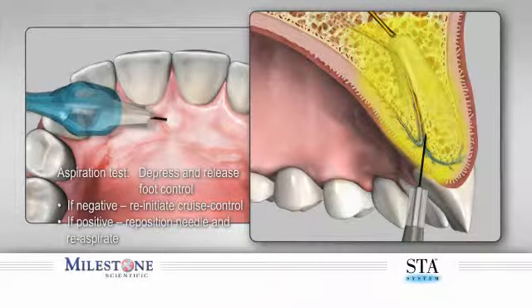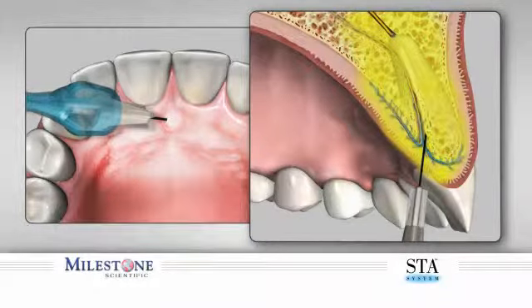If there was a positive aspiration, as determined by observing blood in the hub or tubing, reposition the needle and then re-aspirate before continuing. After you have delivered the proper amount of anesthetic, you will notice diffuse blanching of the tissue.